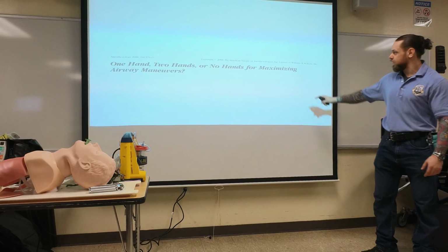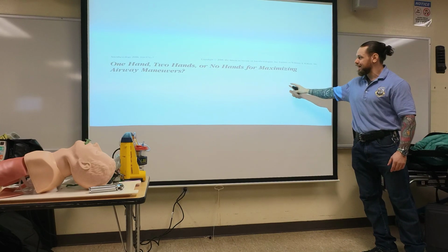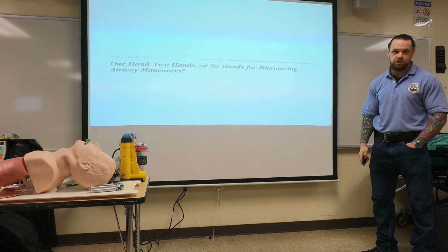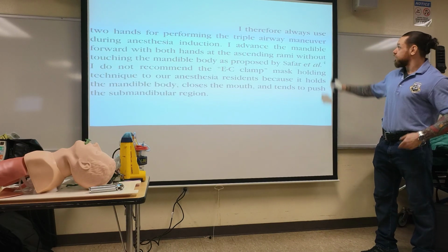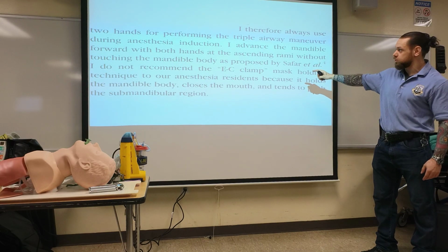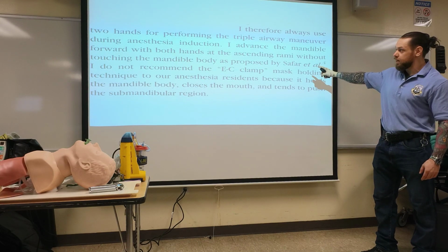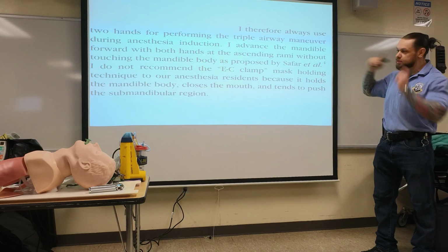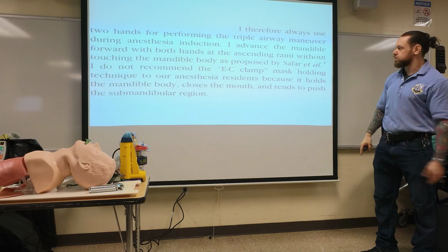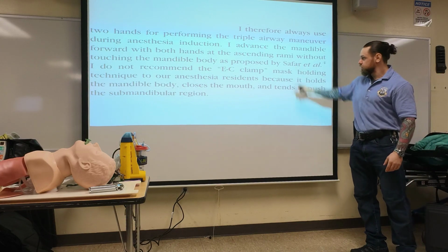This was a study put out by an anesthesiologist, and he's saying 1 hand versus 2 hands. What is he saying? I therefore always use 2 hands performing the triple airway maneuver during anesthesia induction. I advance the mandible with both hands in the ascending rami, the lower mandible, without touching the mandible body, without closing the mouth. That's what Peter Safar said.